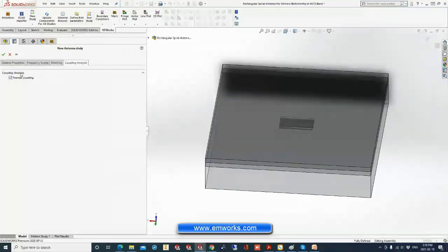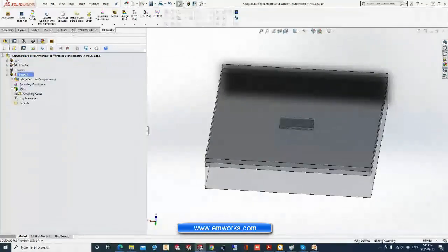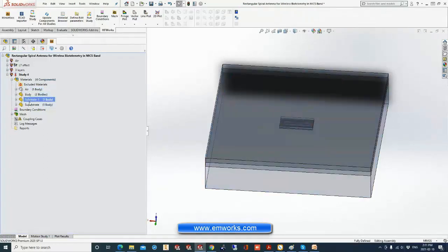HFWorks can be coupled with thermal analysis to predict the temperature distribution due to the losses in the material, from a lossy conductor or from a lossy dielectric material. Here the study is created. As pre-processing steps, we have to assign the material to each body using our material library, or the user can create his own material. It's very easy.